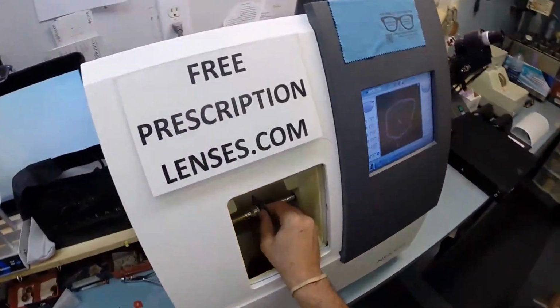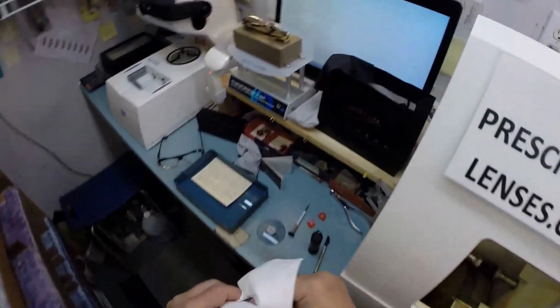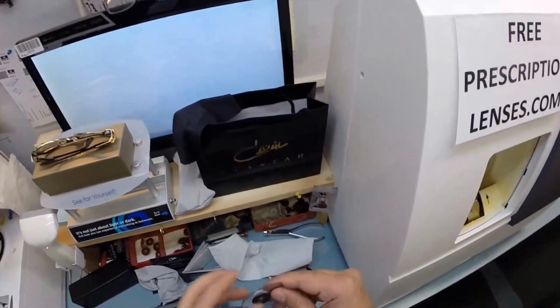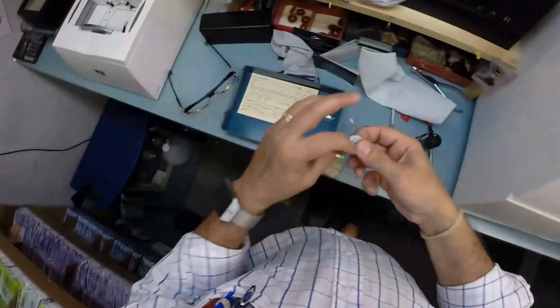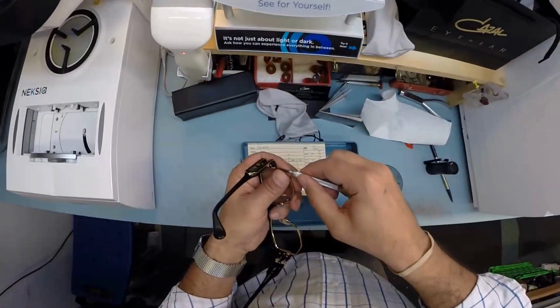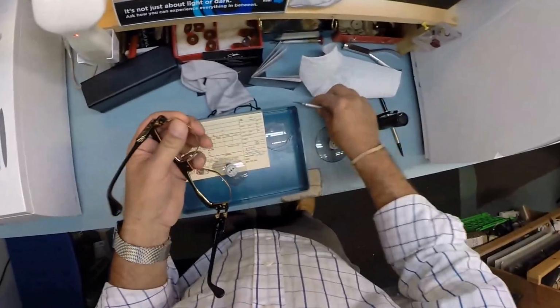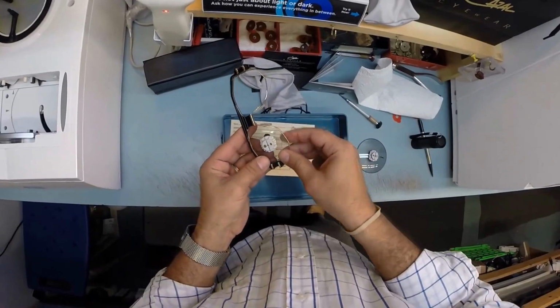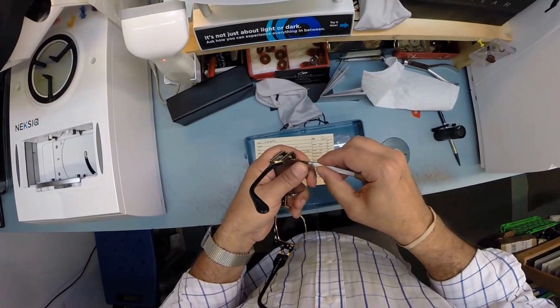So, we're going to take the lens out. Let's dry this off, and we'll see if it fits into your frame. Dry, it also is not slippery. I want to make sure there's no optical debris on the edge of your lens. And then let's see, here's my screwdriver. I'm going to do the old lefty-loosey. Loosen up that eye wire screw. Turn that around. We're going to tuck the lens in. Do a little righty-tighty.